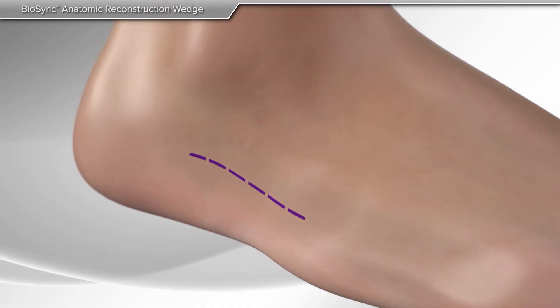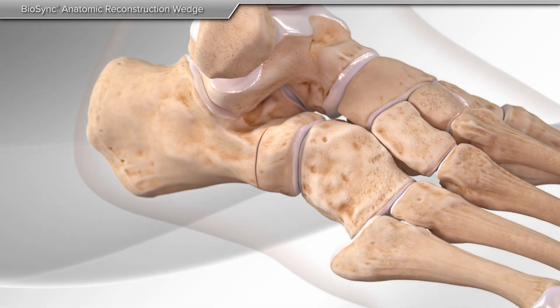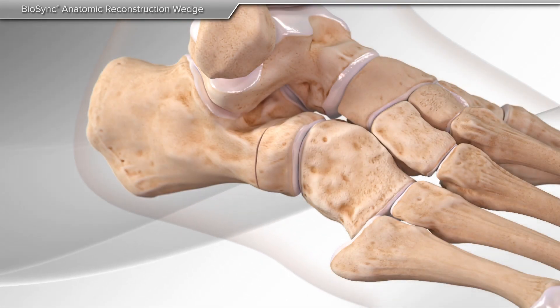In the Evans wedge technique, an incision is made on the outside of the foot. Your surgeon cuts the bone to allow for placement of the Biosync wedge.